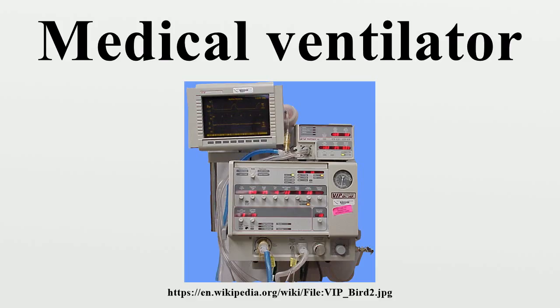The 1955 release of Forrest Bird's Bird Universal Medical Respirator in the United States changed the way mechanical ventilation was performed, with the small green box becoming a familiar piece of medical equipment. The unit was sold as the Bird Mark 7 respirator and informally called the Bird. It was a pneumatic device and therefore required no electrical power source to operate.